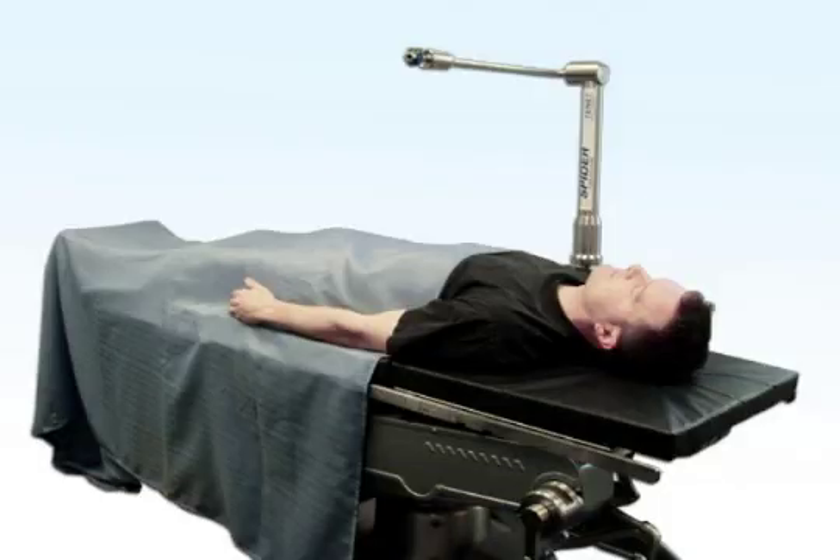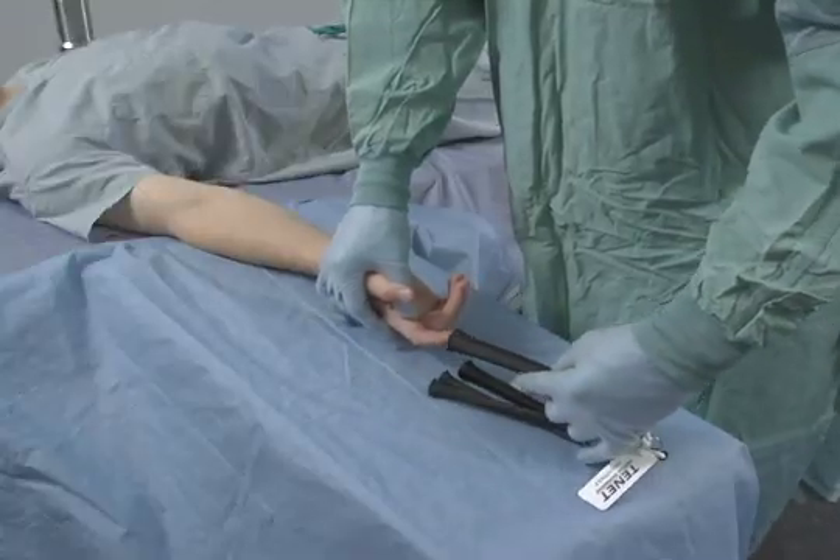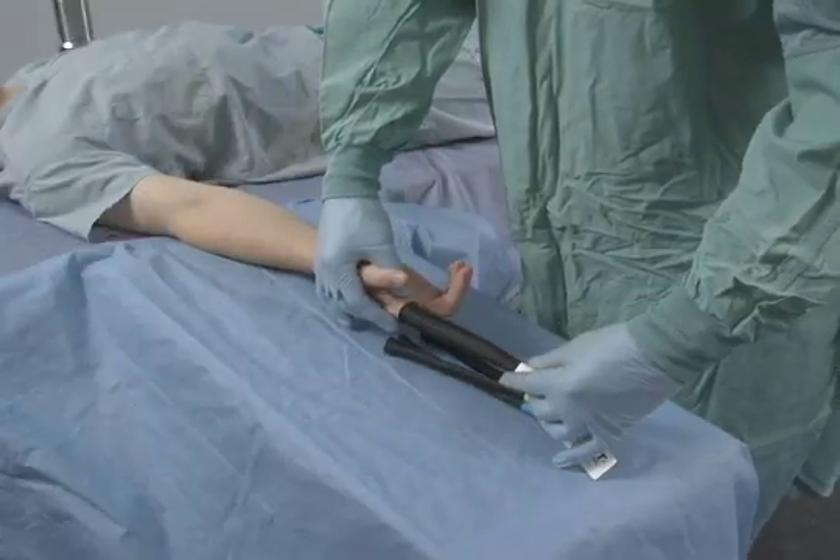The spider is usually attached to the OR table on the non-operative side, beside the patient's chest in a vertical orientation. After the patient is intubated, but prior to prepping the limb, the appropriate wrist stabilisation kit is chosen.